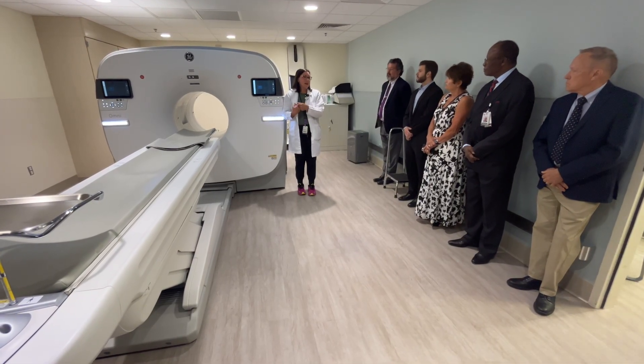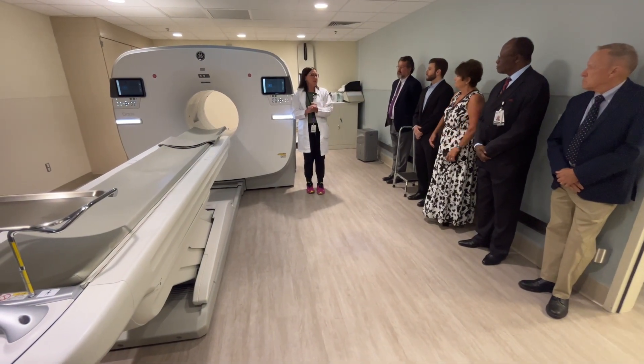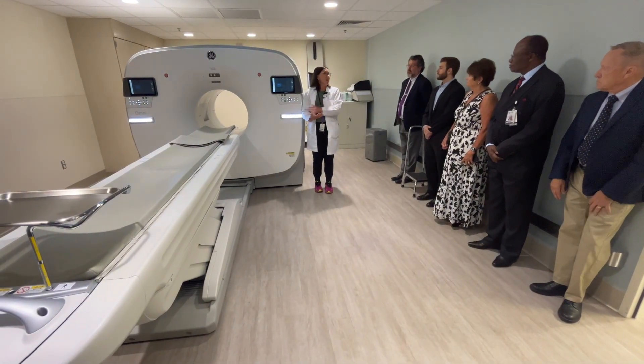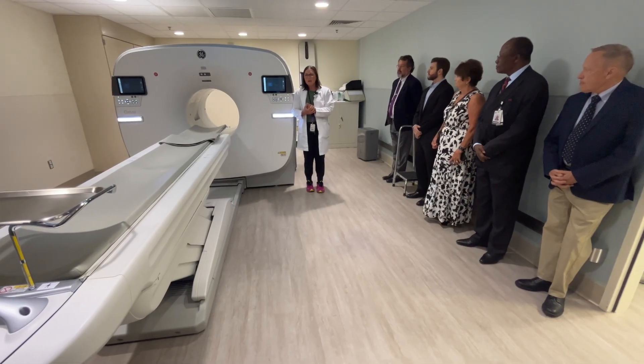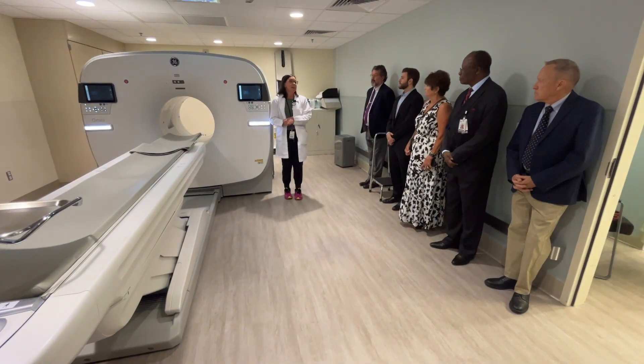This scanner does not operate like an MRI scanner that uses magnets. So patients that have different types of implants or hardware — that is also not a concern. We will see the metal in their body, but it's not going to disqualify them from getting a PET scan.